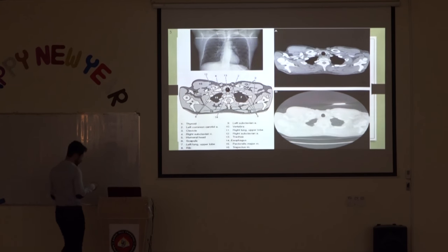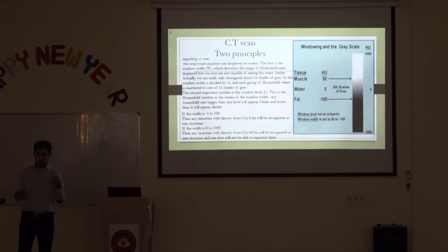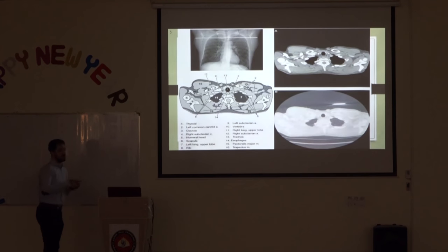From here emerges the following concept. In CT, we have two principles: window width and window level. What is window width?